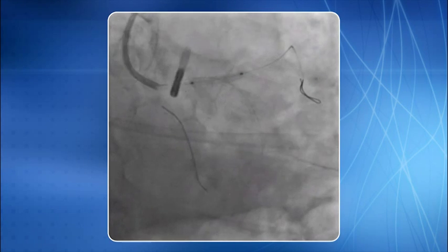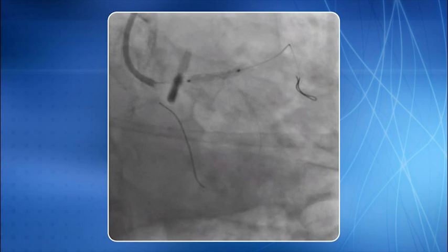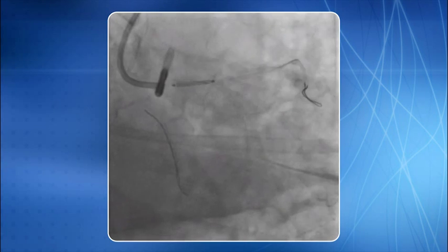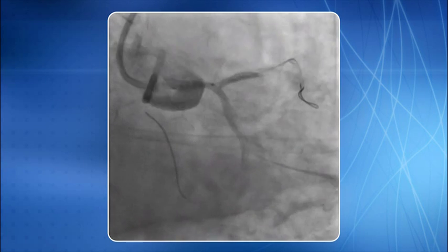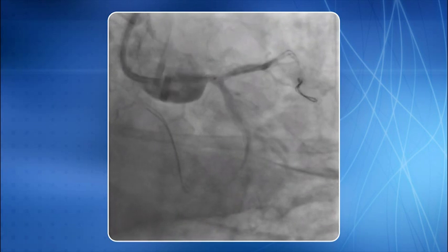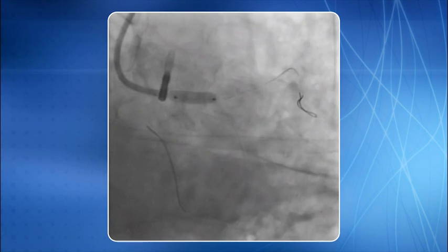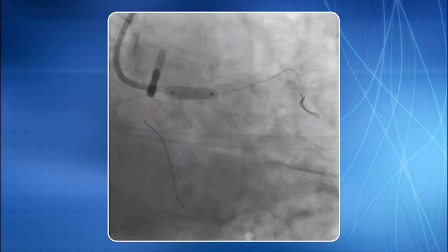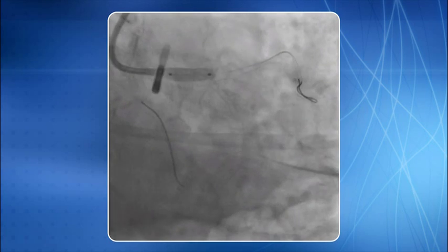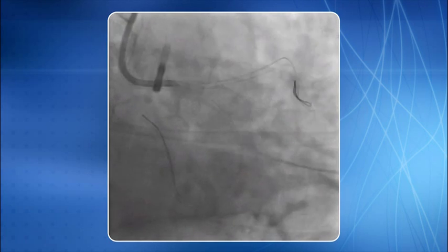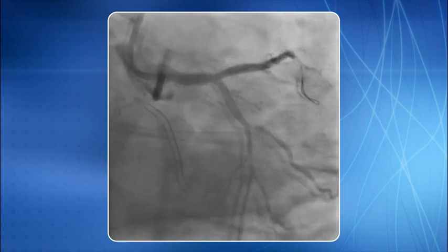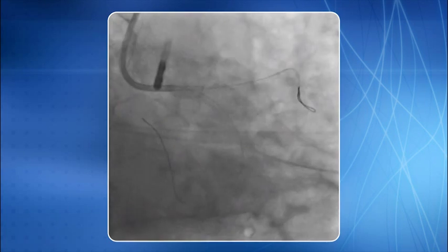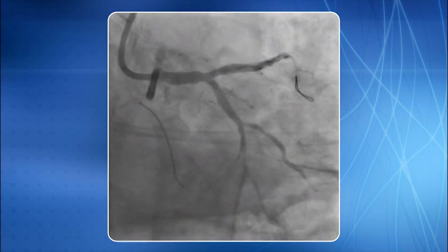PTCA is in progress, followed by stenting in progress. Here you see an excellent result of primary PCI of the LMCA, shown from another view.